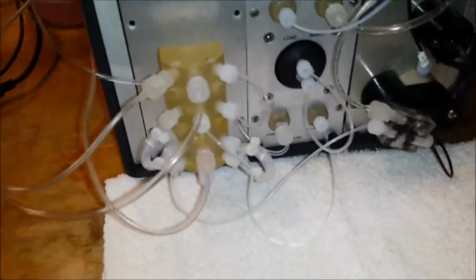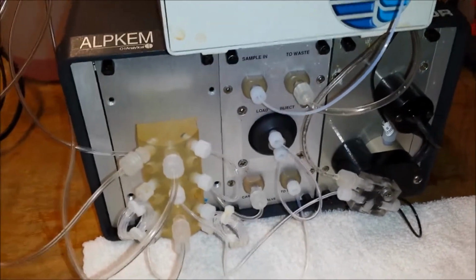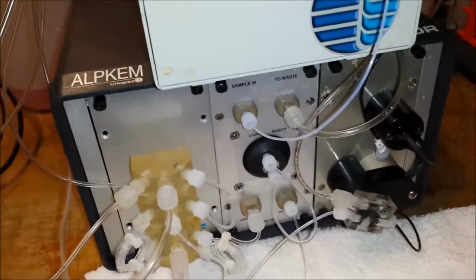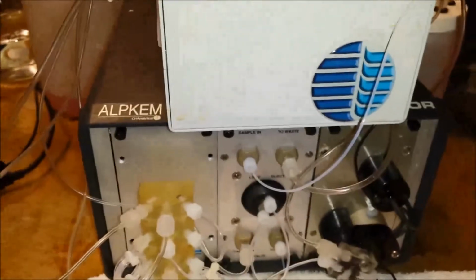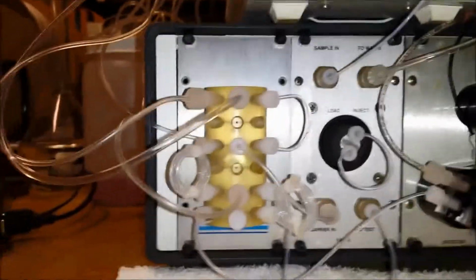So if we have injected air from the loop into the system and we know that the probe and the sample tube and everything is coming into the cartridge, and we have checked the serial communication value and we know that it is correct, and we know our detector is on because you can see the light of the lamp.